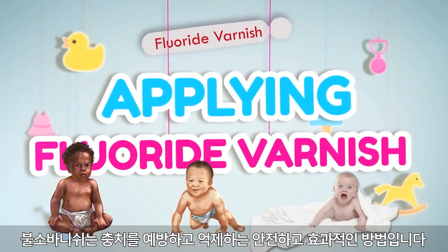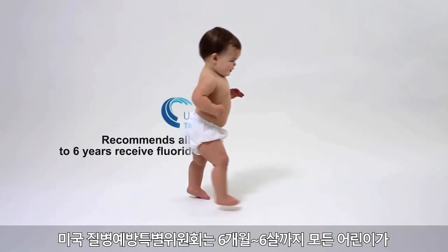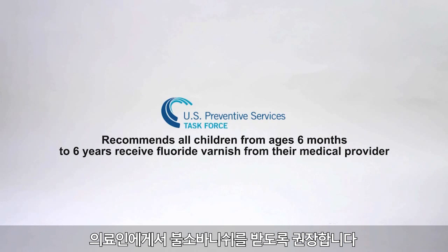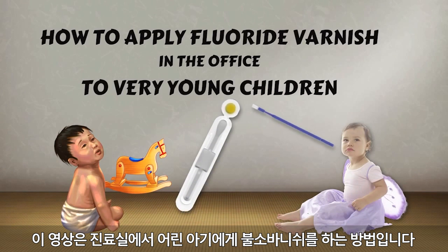Fluoride varnish is a safe and effective way to prevent and control tooth decay. The U.S. Preventive Services Task Force recommends that all children from ages 6 months to 6 years receive fluoride varnish from their medical provider. In this video, we will demonstrate how to apply fluoride varnish in the office to very young children.